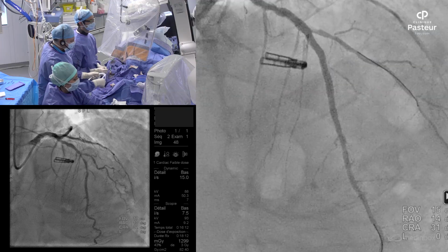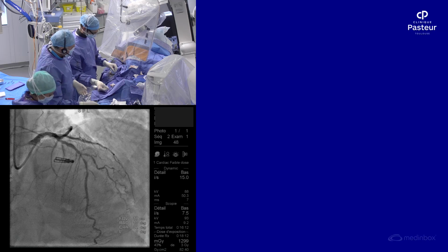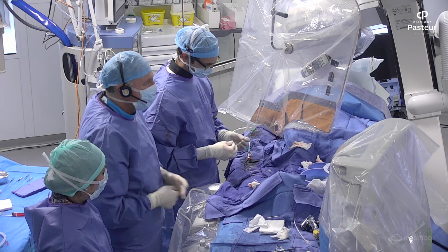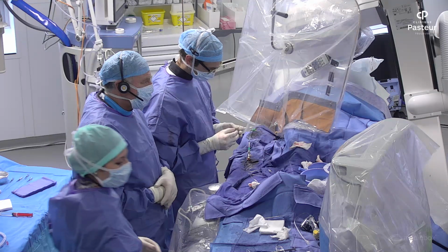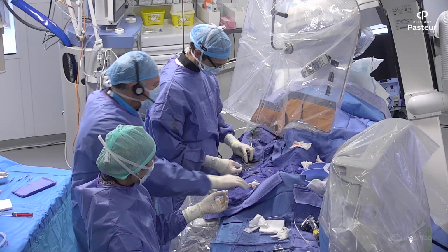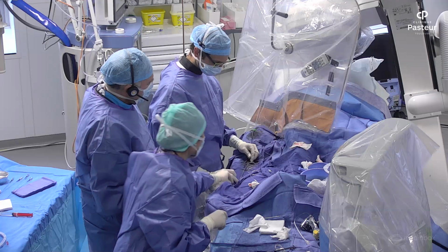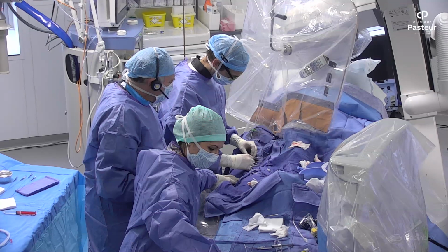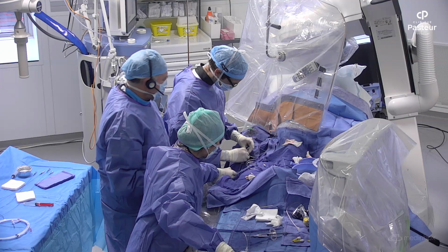Good to know that no one thinks another stent adds any benefit. Would anyone use a pressure wire or iFR? Would they use a functional test? Would anybody use a functional test here to assess the diagonal? This is a nice question because it has been clearly demonstrated that pressure wires through the side branch after stenting give absolutely no help. Anything you get has nothing to do with the clinical outcome. Most of these lesions are negative, because they supply small areas of myocardium usually.